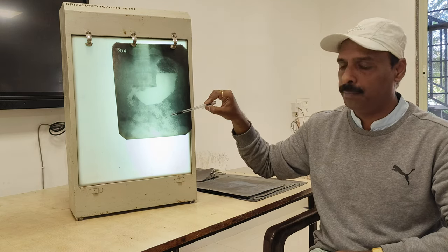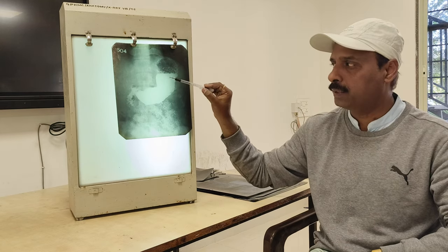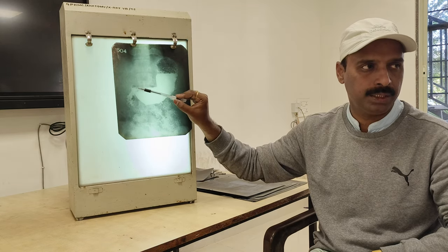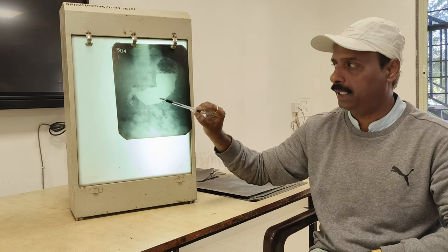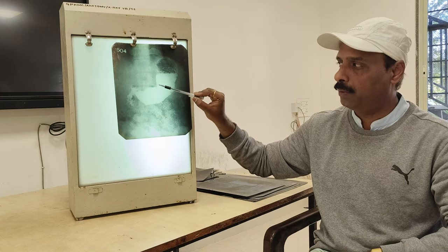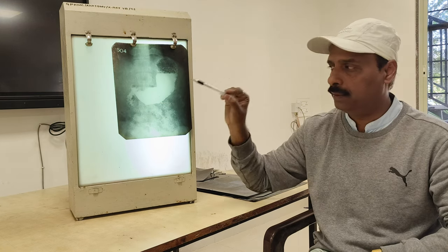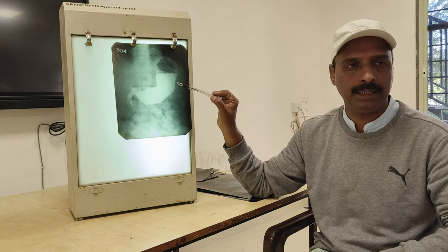Then the other part you can see is the lumbar vertebrae. That is all important, but most important is that it is a barium meal x-ray, and you have to explain the different parts of the stomach, including the duodenal cap, which is the most important clinical anatomy you have to find in the normal x-ray. And you have the angular notch in the stomach. The outline is like a marking, and if the outline is not disturbed by anything, then it is called normal.